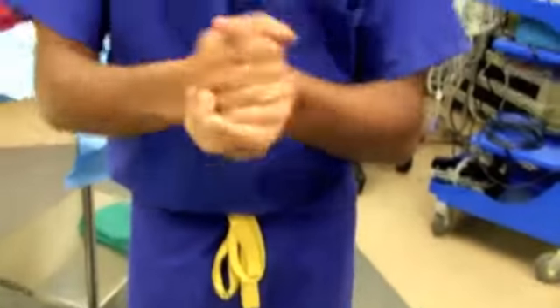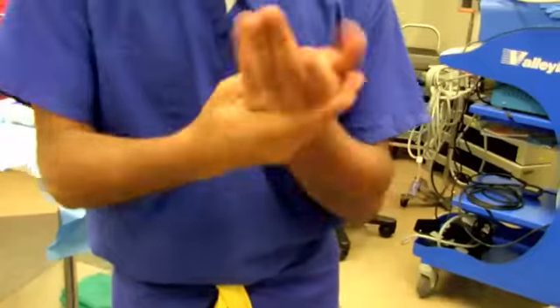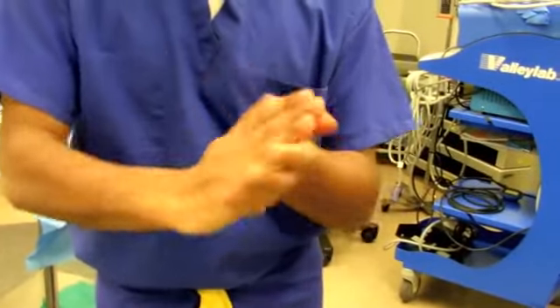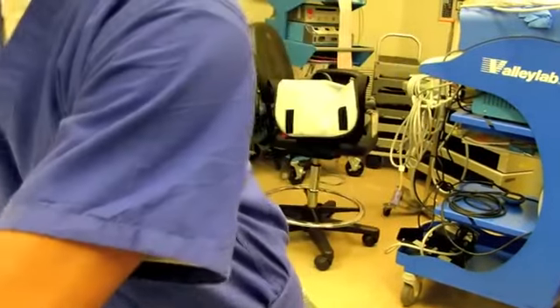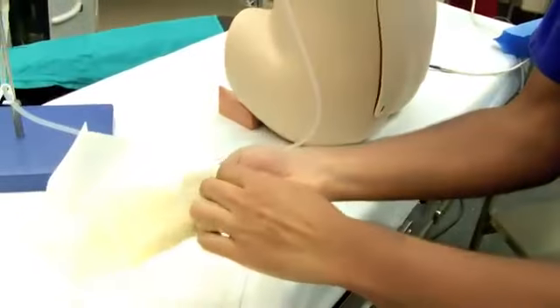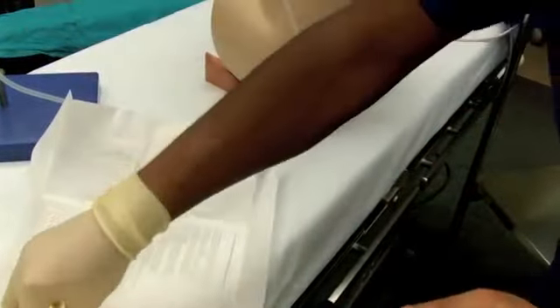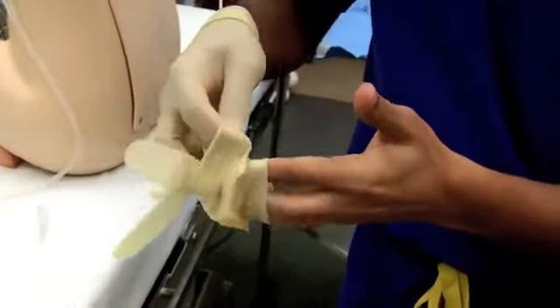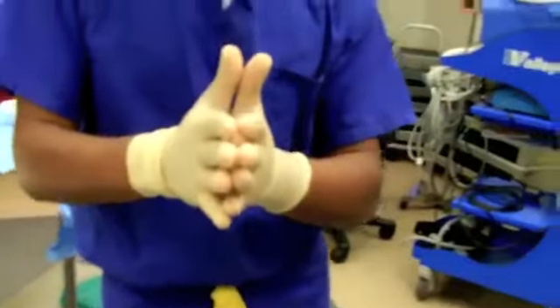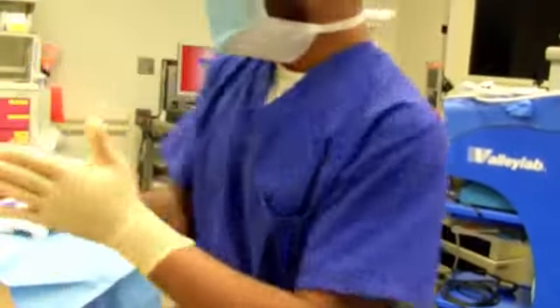I'm going to wash my hands with gel. Once dry, I'll put on my sterile gloves. In the next step, we will apply the sterile drapes.